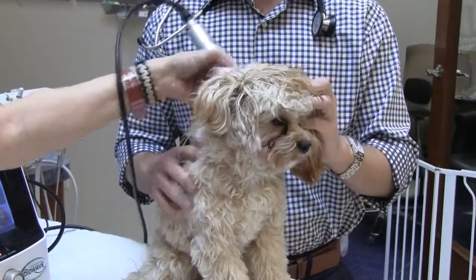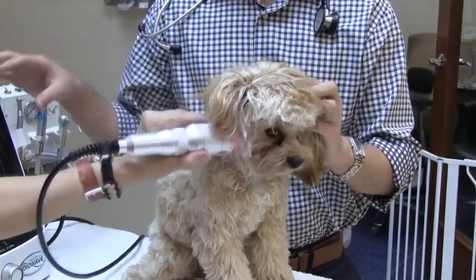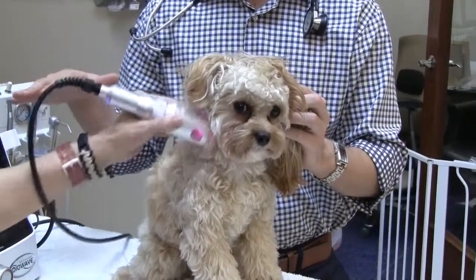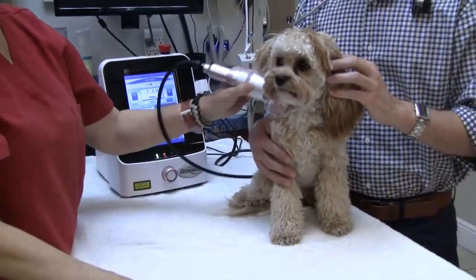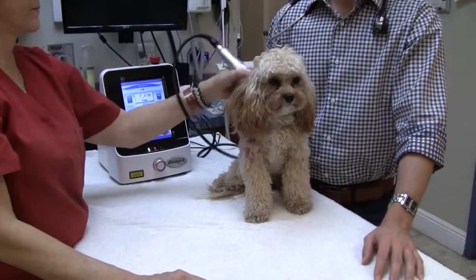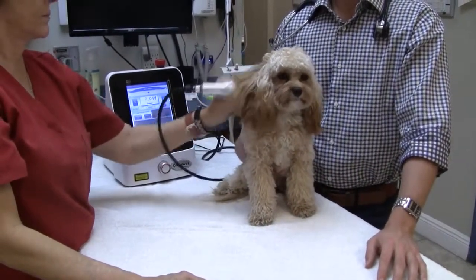The other thing that you don't have to worry about is how long you're lasering for, because like Cindy says, it presets the timer for you and it's counting down, and once the time is over, it will automatically shut down the laser. It helps when you have a perfect patient. Some of the patients will actually enjoy this, and sometimes they'll calm down during the therapy because it is so soothing to them.